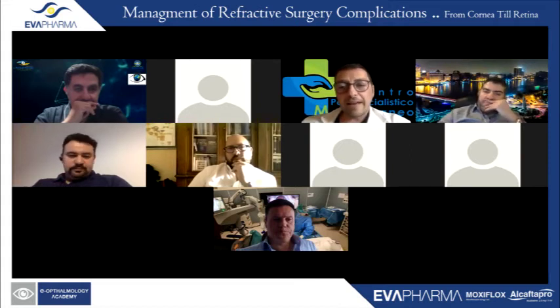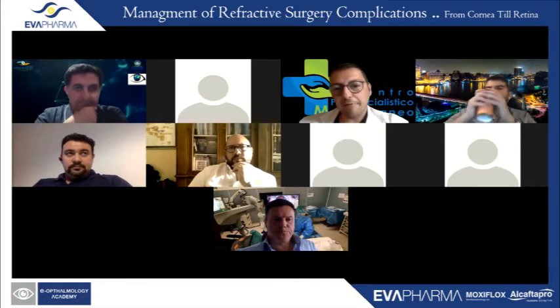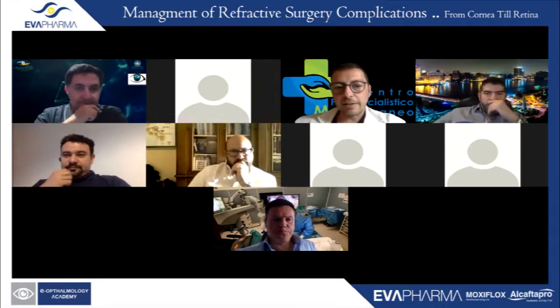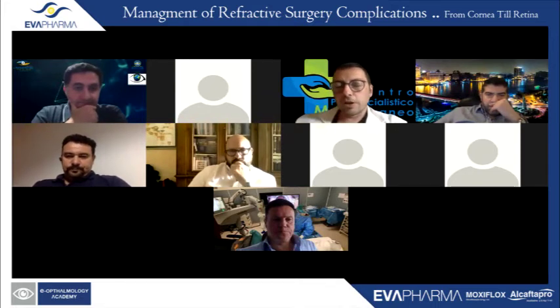But when you have an ectasia, when you have a scar, trans-PRK, you cannot calculate. So I prefer to do it manually in these cases, and after smooth the cornea with PTK. So you have to think at the origin of the scar, the origin of the ectasia, and then adapt. But if you have a very faint scar, you can do trans-PRK or PTK without any problem, because the ablation rate will not be very different from a normal cornea.